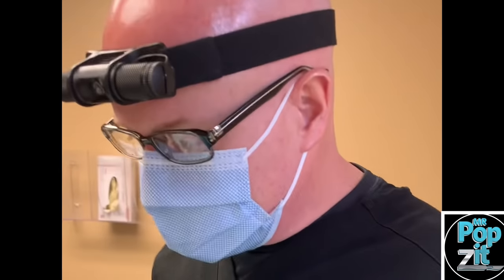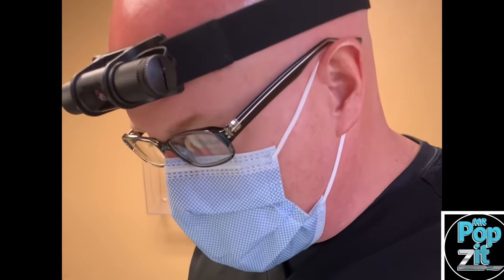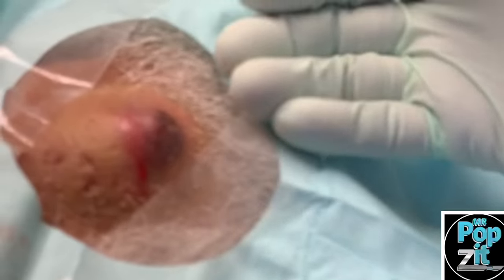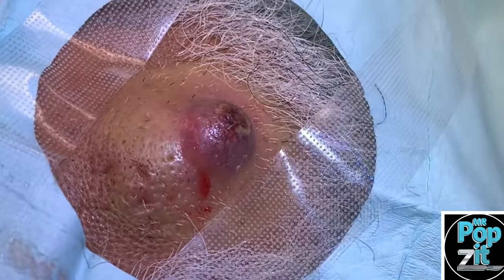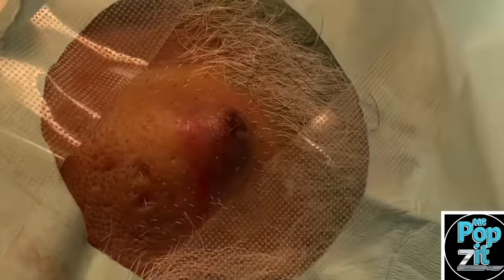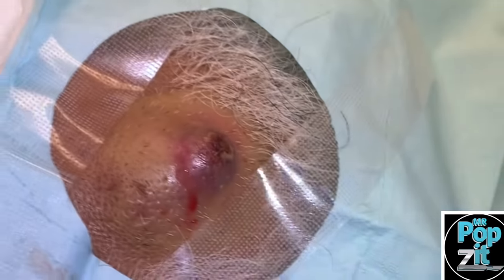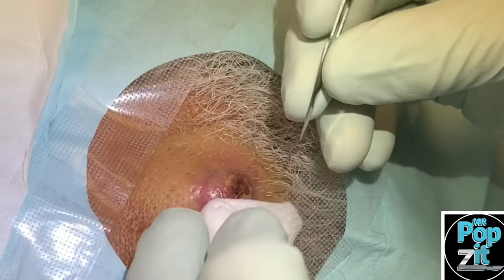We have a large abscess on the right cheek. We have it as numb as we can get it, given that acid-base shift in inflamed abscesses and infections. We're going to do an I&D now and try to drain a little bit into a receptacle with a little bit of pressure. I have a feeling we may see some cyst particles — it was probably an inflamed cyst. We'll go very slowly so we don't want them to feel too much pain or stinging.